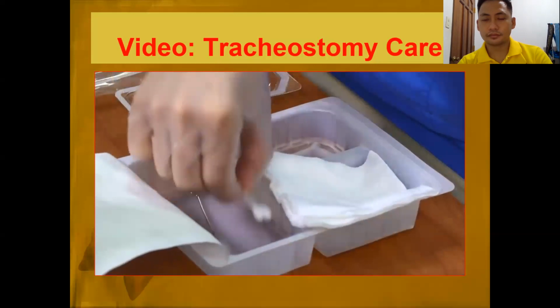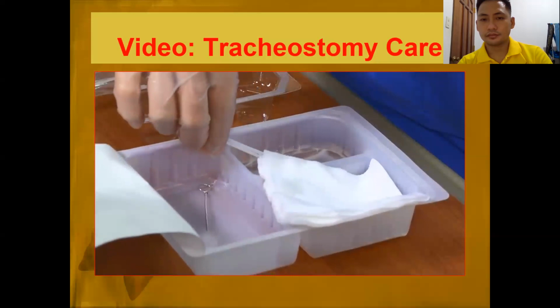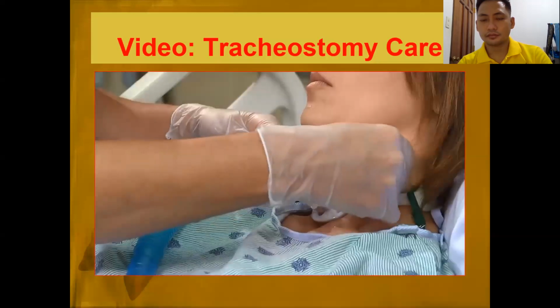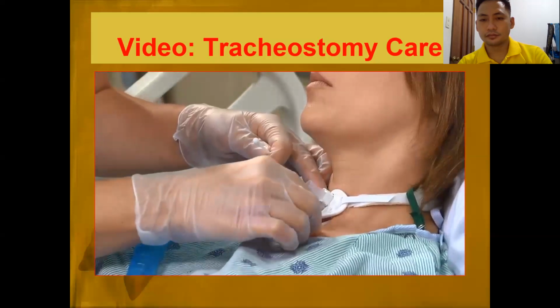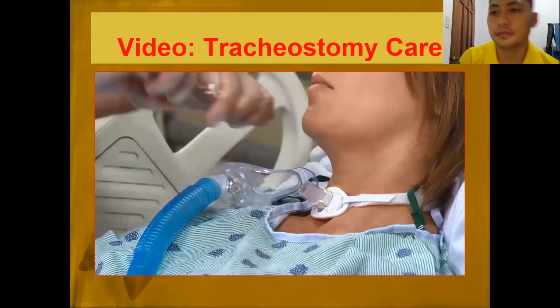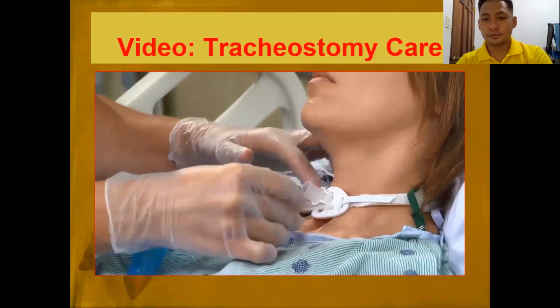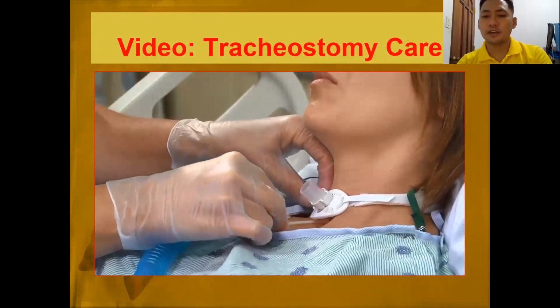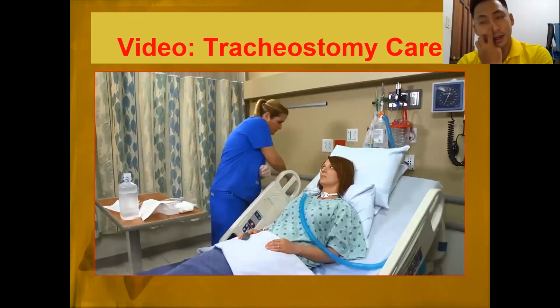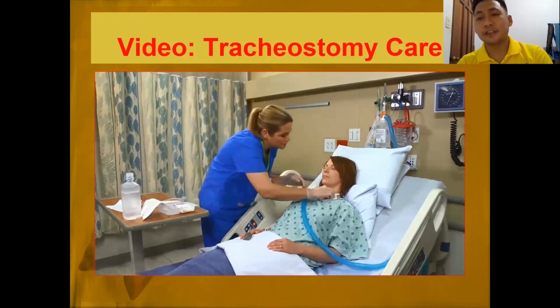Then clean the stoma. Begin at the inner edge and move outward in circles, covering a 2 to 4 inch margin around the stoma. Be sure to include the area under the faceplate. Of course, when you clean, you also have to observe any signs of infection in the stoma. There might be irritation and infection.